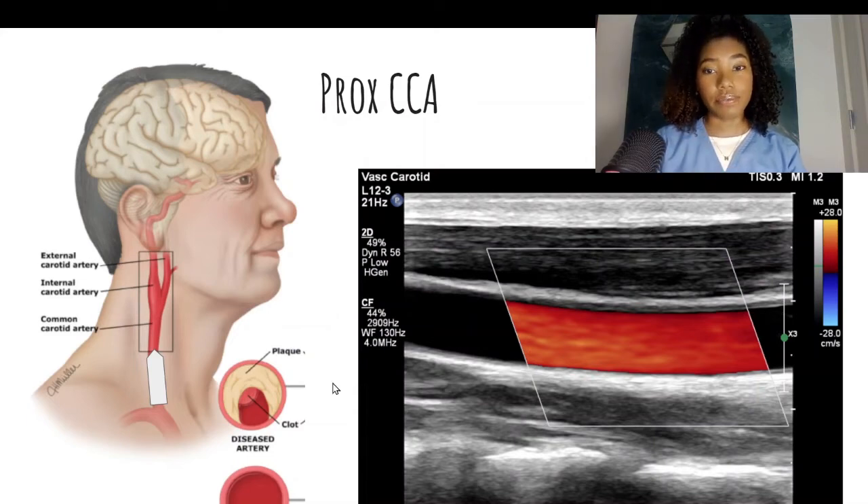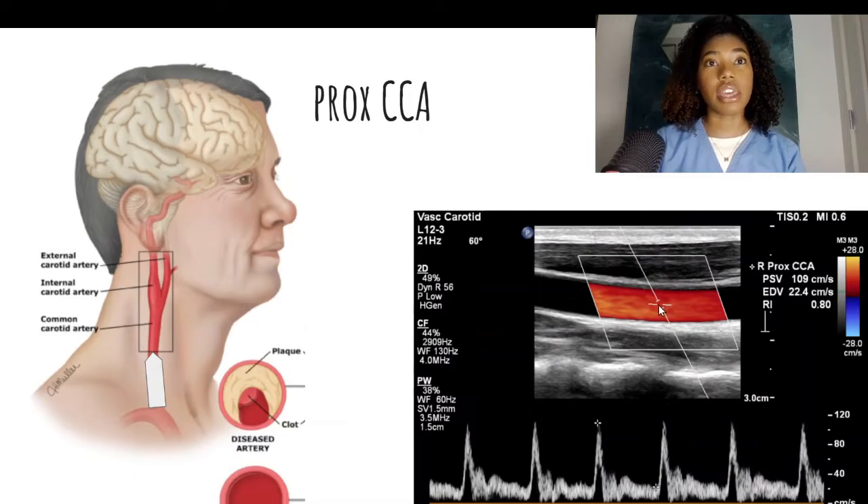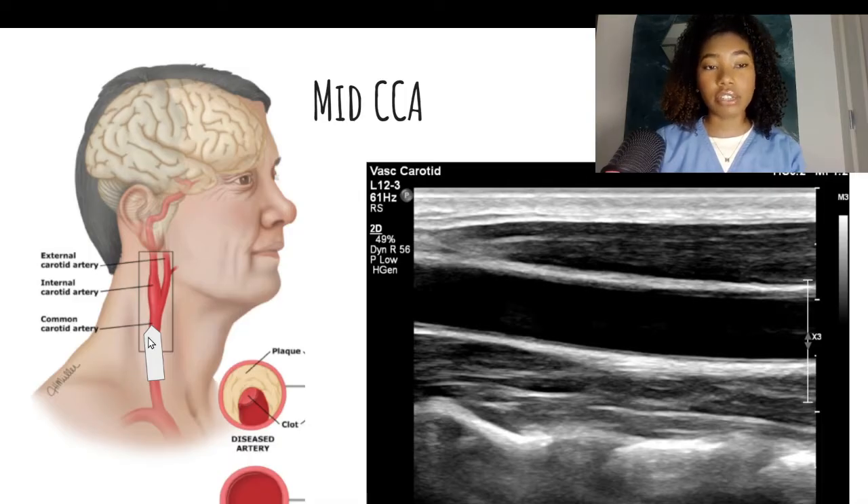At the center of the vessel is where you will obtain the best velocities and clearest spectral window. You are going to measure the peak systolic velocity, which is the highest point on the spectral waveform, and then the end diastolic velocity, the lowest point right before the upstroke. Make sure to add these measurements to the machine's measurement packet. In the common carotid artery, the waveform should be a mix of high resistive and low resistive flow. Next, we are going to keep the notch pointed towards the patient's head and move a little bit superiorly to image the mid-common carotid artery.